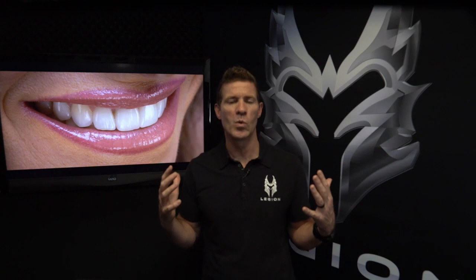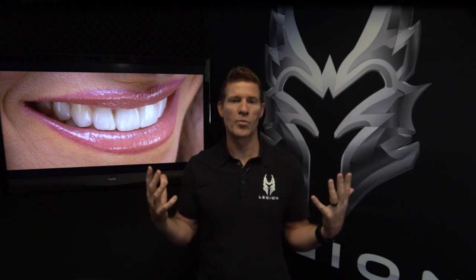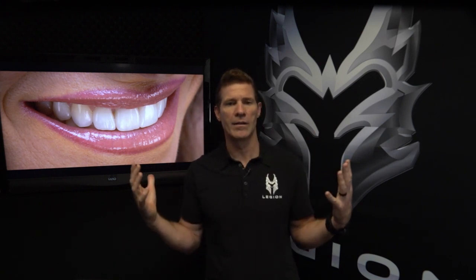So again, the buccal corridor. When we're looking from the front and from the side, do we have the ability to change the buccal corridor? Can we fill it in more? Do we have the ability to maybe do no prep designs where we can just add veneers to add bulk to the tooth to make it look like it's filled the entire smile? There's only so much you can go based on skeletal position, but can we modify that to give someone a fuller smile so we don't have this dead space or this black area? So again, potentially getting to do some additive dentistry to create a better appearance of a wider smile without having to reduce any tooth structure.